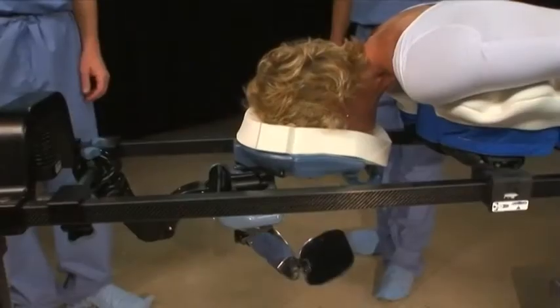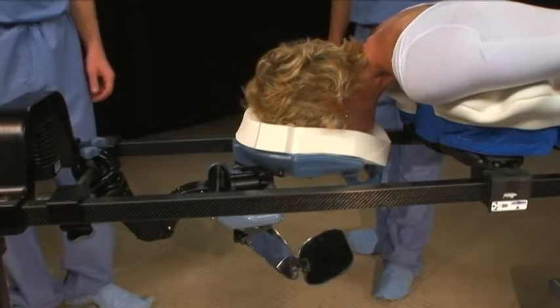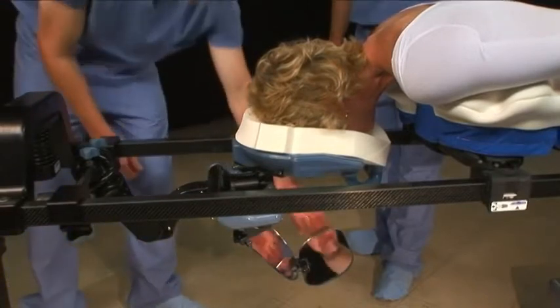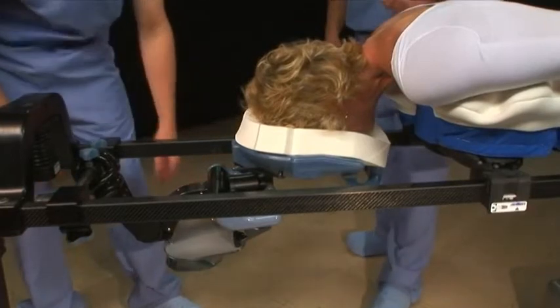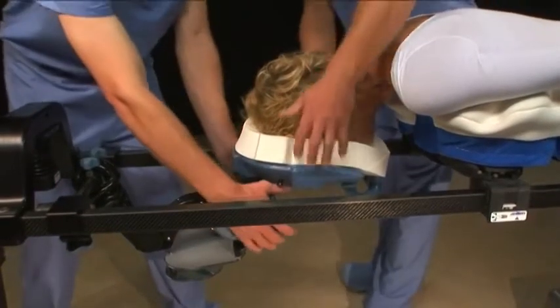The C-flex can always be used in place of the C-prone. The C-flex allows a wider range of positions and may be useful when working with extremely kyphotic patients, those with severe scoliosis, or when traction is required.